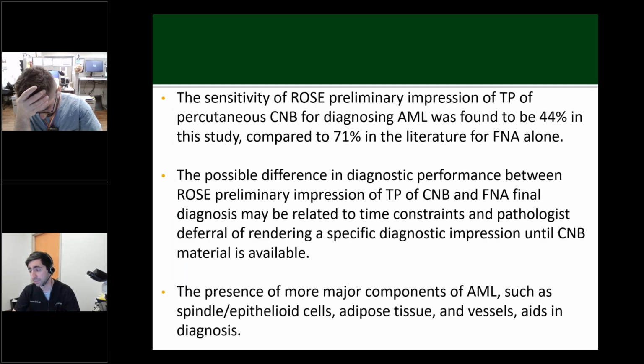The sensitivity of the preliminary impressions during ROSE on these touch preps was found to be around 44% in this study, compared to the 71% reported in the literature for FNA alone.